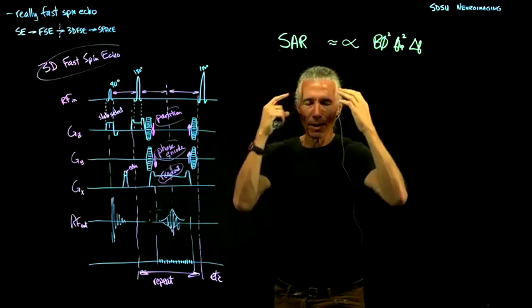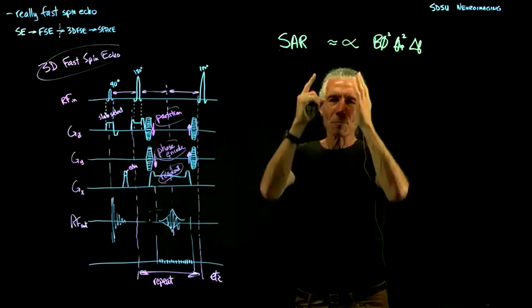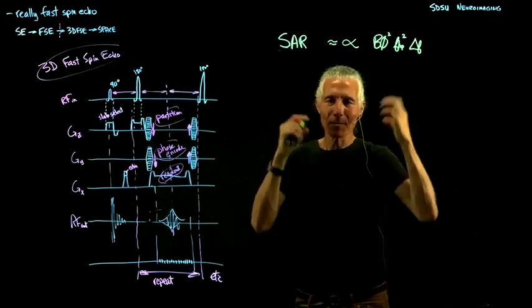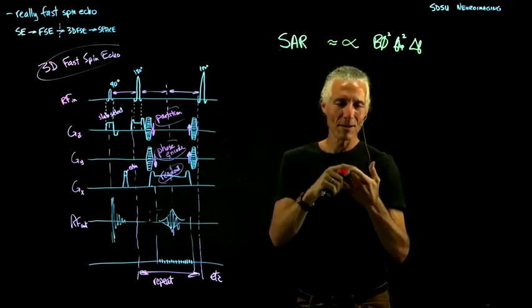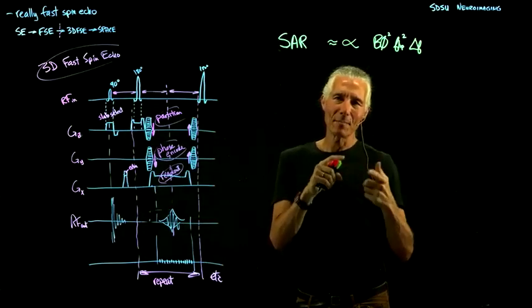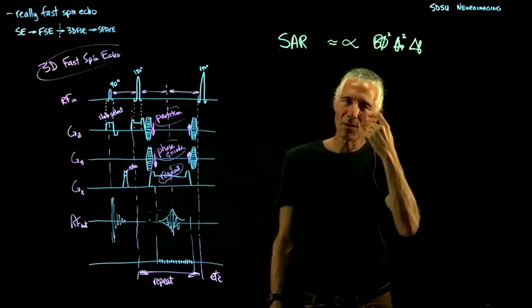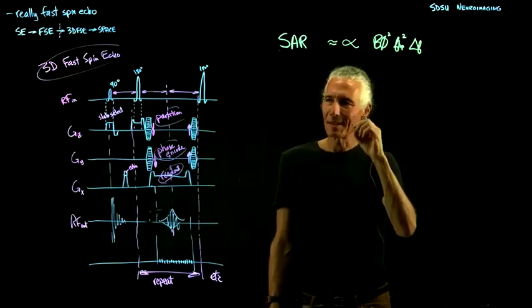For something like the brain, it's a particularly safe thing to scan because it's got a huge blood supply, because 10 or 20% of your whole metabolism is just supporting the brain. So if you heat up the brain a little bit, no problem, the blood's going in and out. It's like your finger: you have a good blood supply in your finger, so if you heat it up, it will quickly get back to normal temperature because there's blood going through it. There's other things that are not so good, like the cornea. The circulation in the cornea is much slighter than the circulation going through the brain.